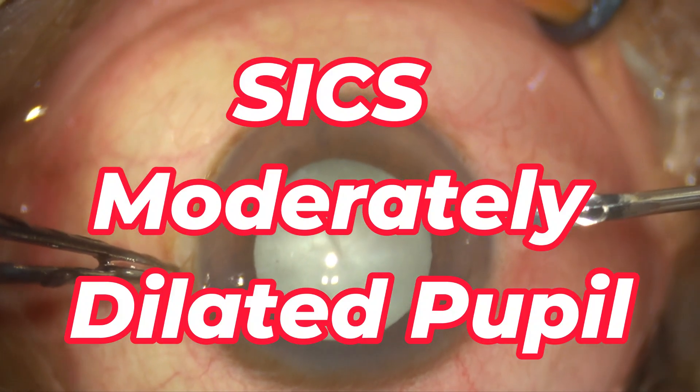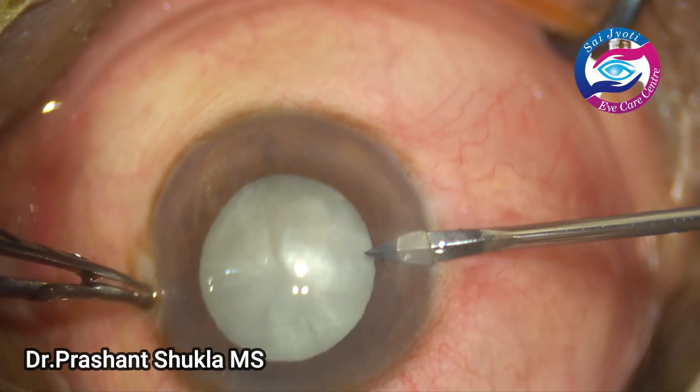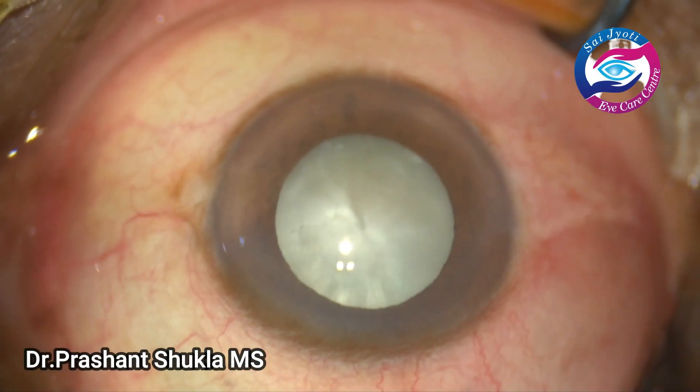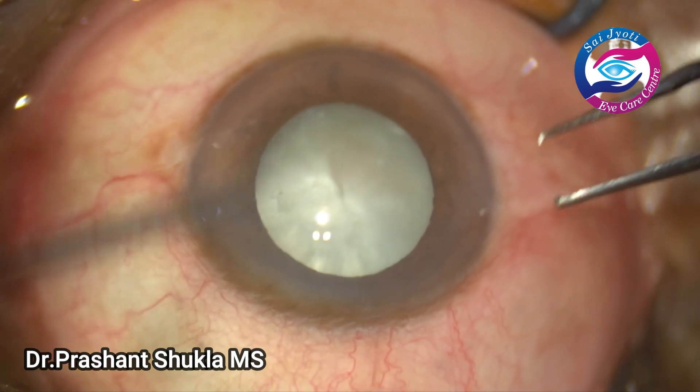Hello and welcome to the channel. Today I am back with a routine small incision case with a moderated miotic pupil. Let's see the surgery now.